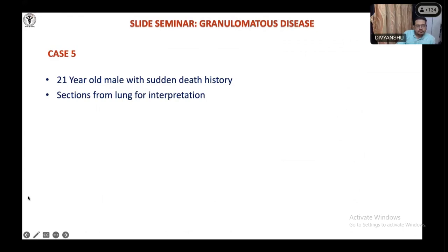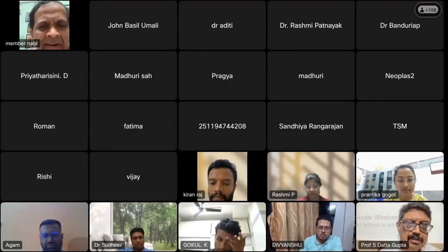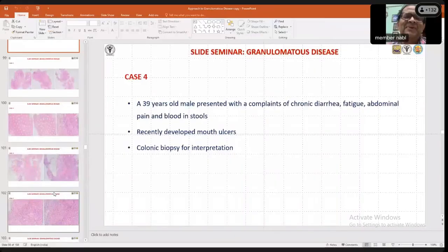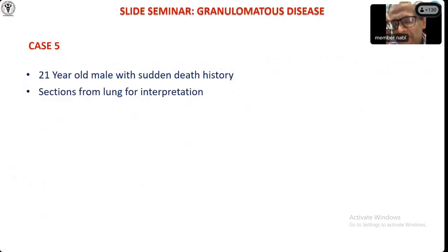Yes, please. One important point is when a patient with ulcerative colitis is on treatment and responding to a very good extent, the inflammation is down and he is recovering with near maintenance of the architectural pattern. Along with that, if there is a crypt granuloma, you see, if it is a known case of ulcerative colitis, then of course you have to take the other features into account. But if it comes for the first time, then it becomes difficult. Then you have to see whether the inflammation is continuous, starting from the rectum, or patchy, and so on and so forth.